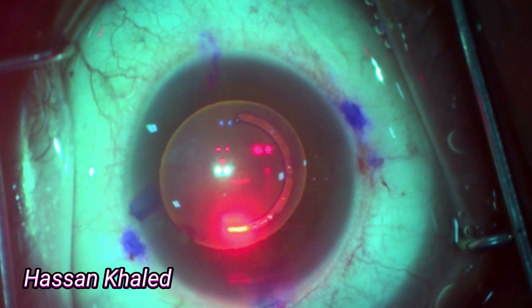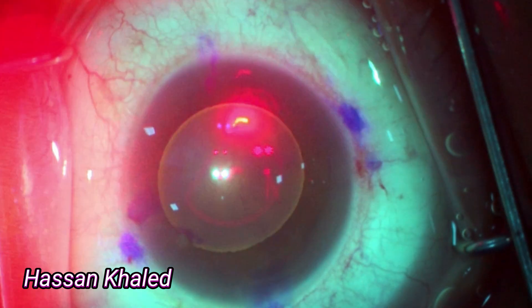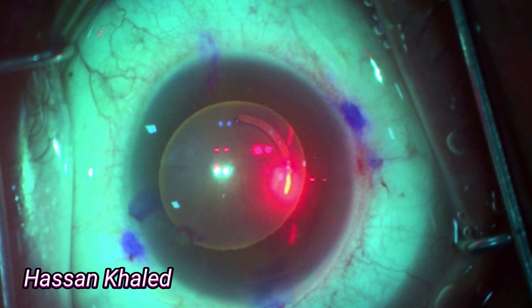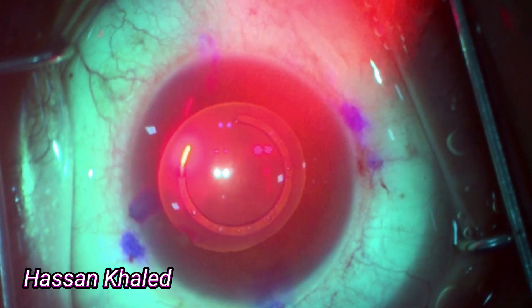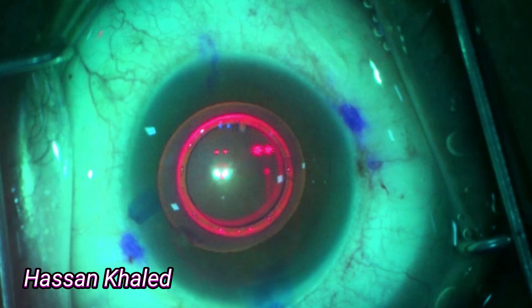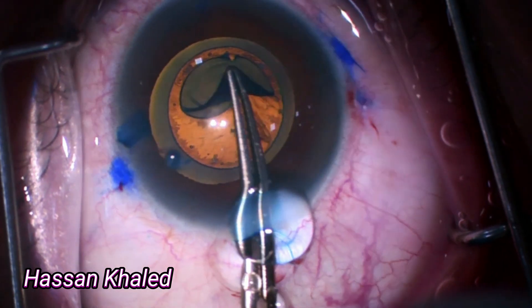Now applying the laser — you can see in slow motion a beautiful 360° cutting of the anterior capsule, resulting in a well-centered, well-sized capsulorrhexis. You can also see it is concentric with the TCL and is not concentric with the pupil.